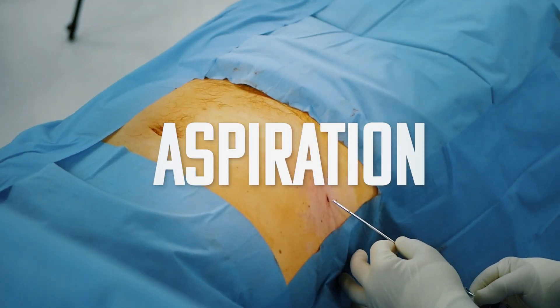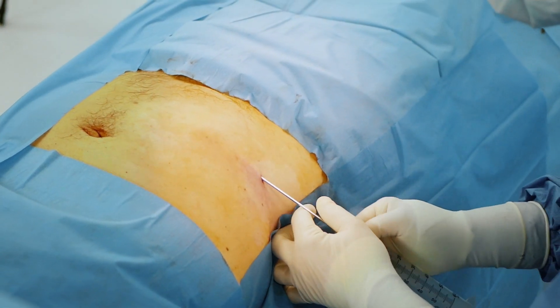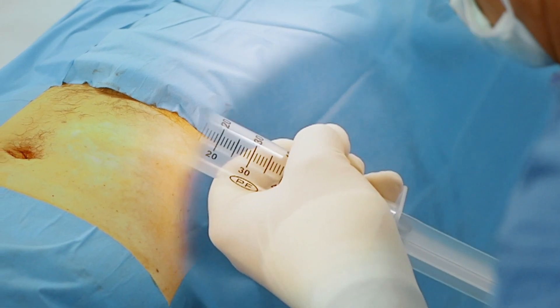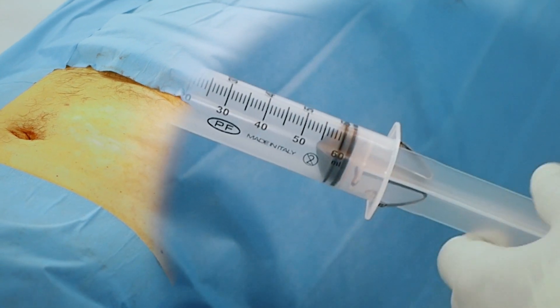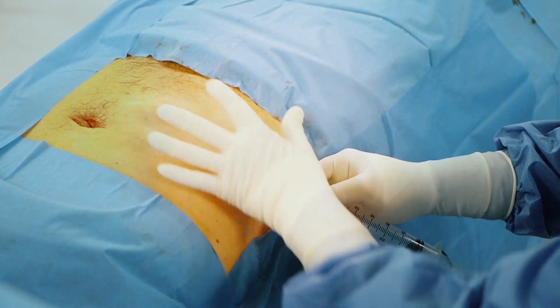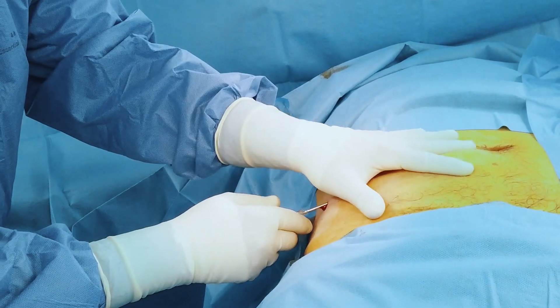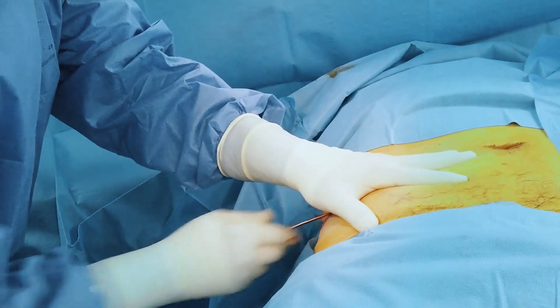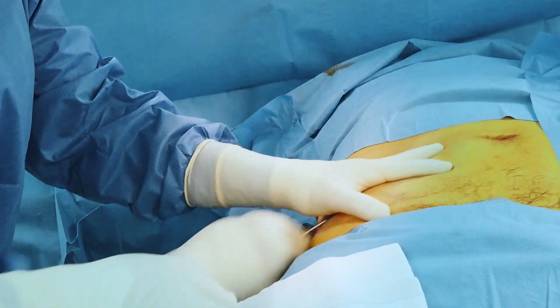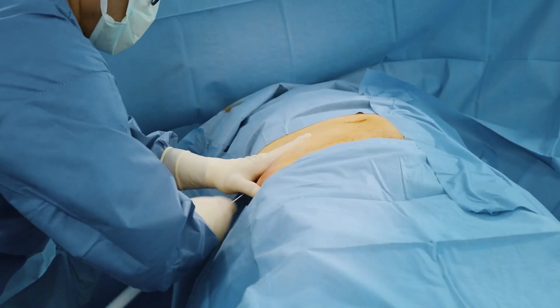After 10 minutes, it is possible to connect the aspirating cannula to the self-blocking syringe. The block system, operated while the cannula is inside the subcutaneous adipose paniculus, creates negative pressure inside the syringe. Move the syringe back and forth to allow the harvesting of the lipoaspirate from the previously infiltrated areas. Avoid transverse movements with the cannulas.